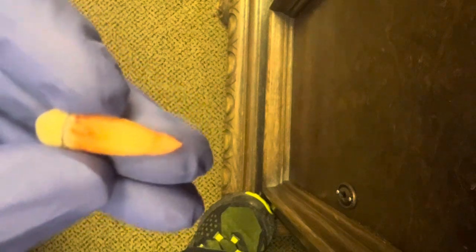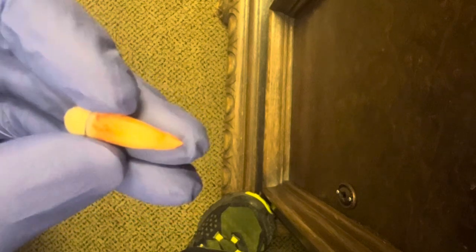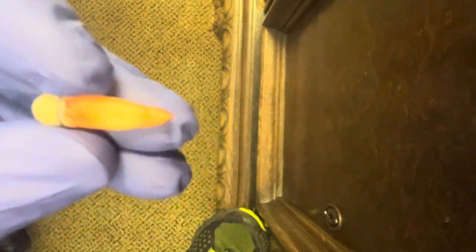You see that little circle on that tooth and it's really hard to see. Let's get it bigger and rip that back off. Just pull it. No, the other way. And now. Great.